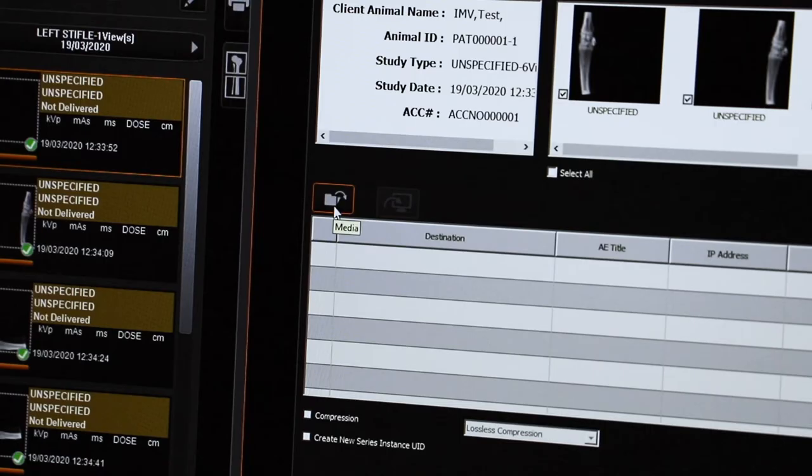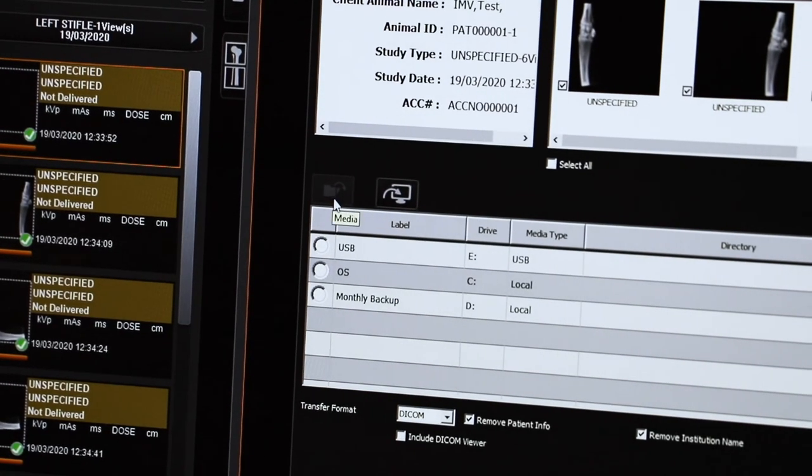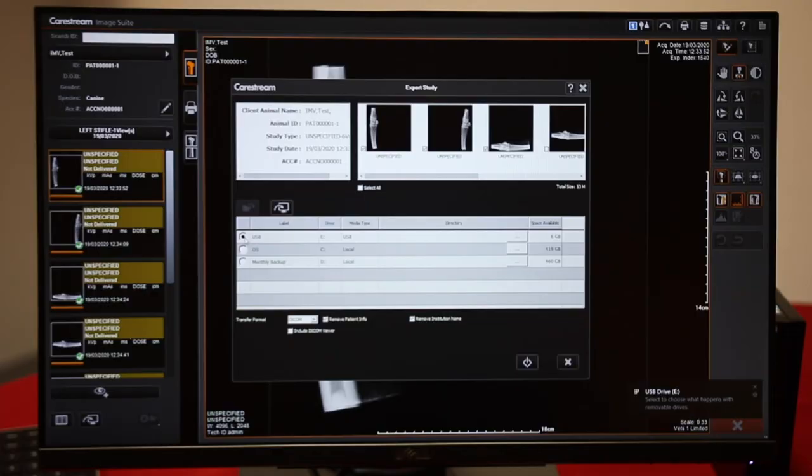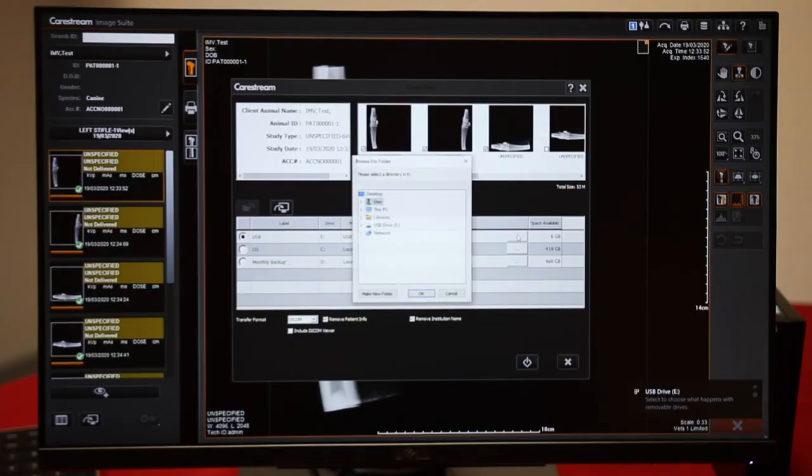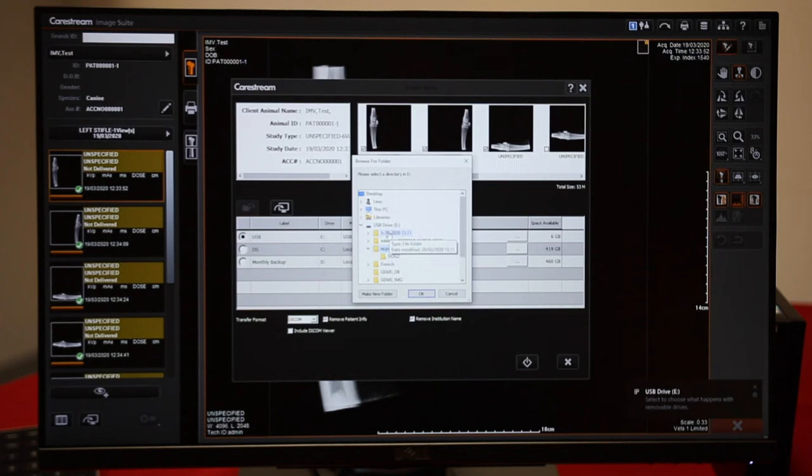Select your media. Here I'm going to pick USB. We need to click in here to select a folder. Press OK.